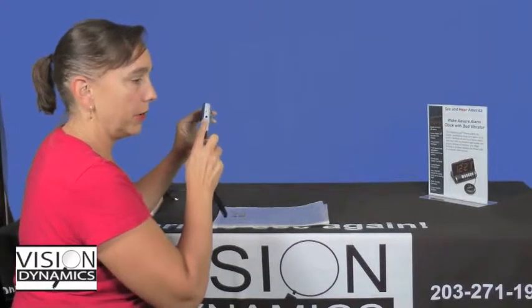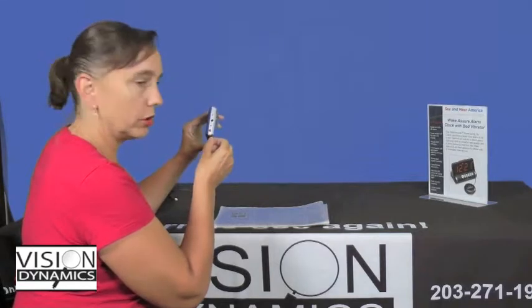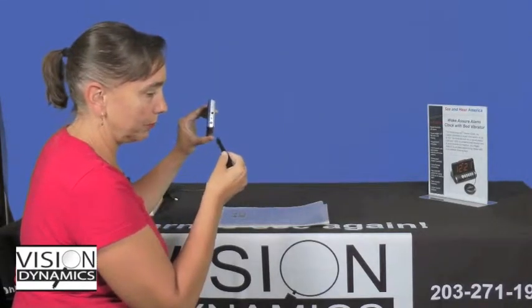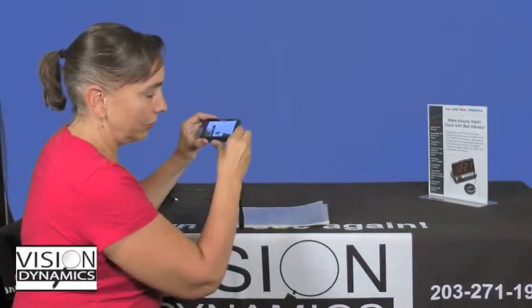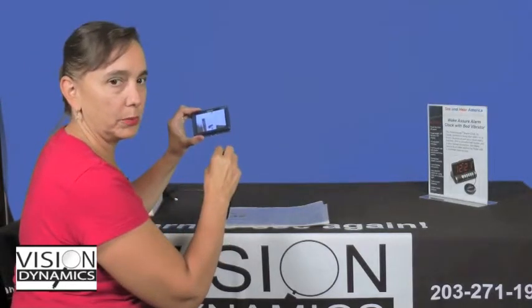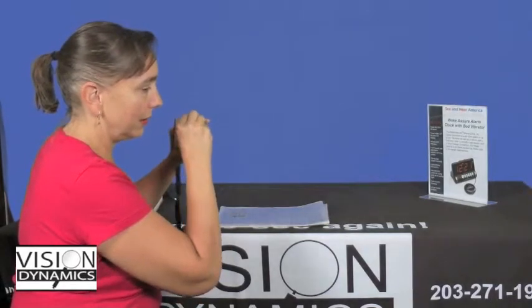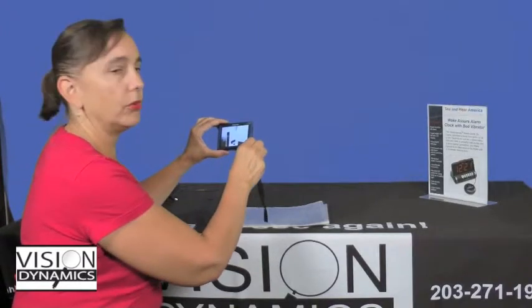On-off button. Above the on-off button is the hole where you stick the charger in. Below your on-off button is where you put your wristband thread through. Below that, underneath the Mini, on the bottom panel, is your two-function button. Swinging it side to side changes the size of the print, and pressing it in is going to change your color mode. You've got your stand in the back, and then on the very top, your capture button. So that's a quick review. Now we'll go into more detail using the functions, and I'll show you on paper.